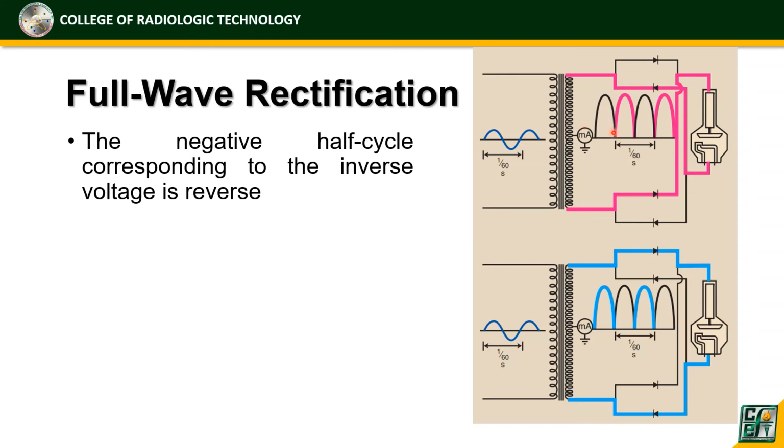So itong pink na to, instead na dito siya sa baba, mag-flip over siya into another positive wave.